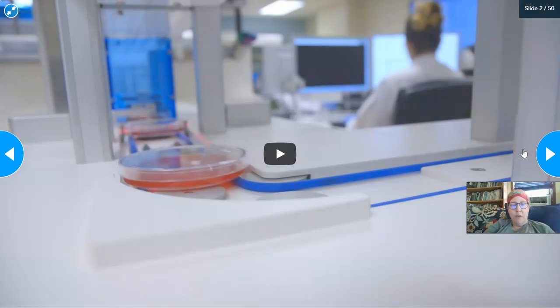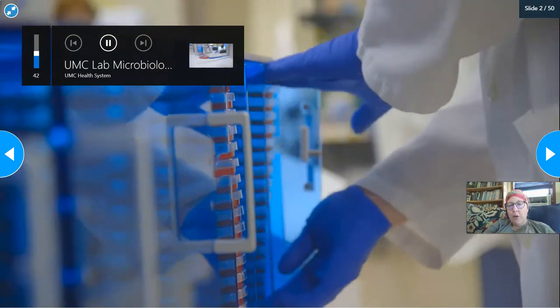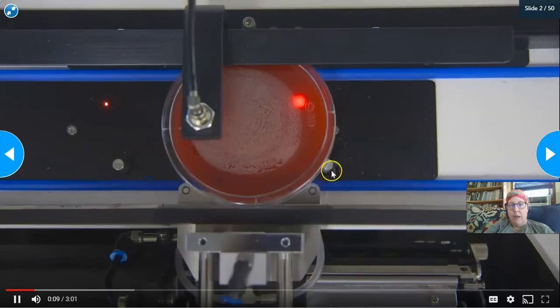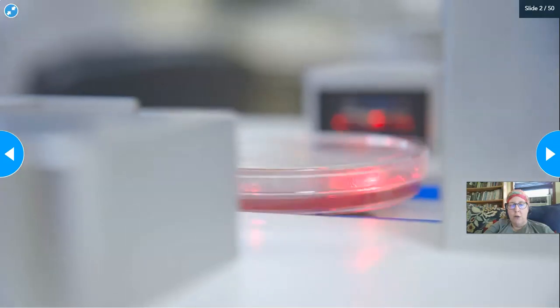All right, so I'm going to play this video. I think you might be able to hear it slightly in the background. I want to show you what the newest in microbiology automation is. You'll hear the music a little bit in the background. Microbiology is actually one of the last areas to get automation. Automation has been around the lab, especially chemistry and hematology and all of that. And so we have finally got a system here in the lab that's automated.